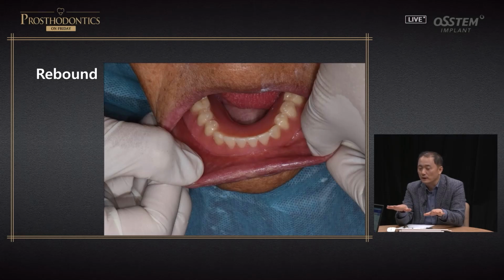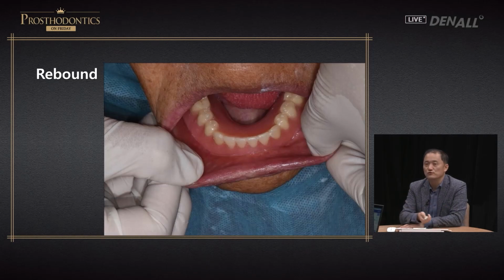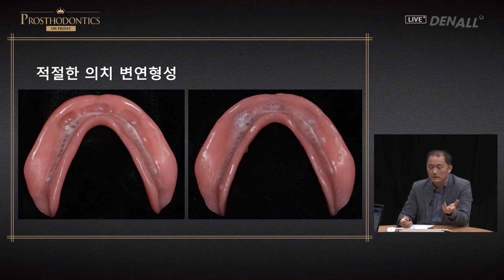In other words, the load that can go in on the side can be eliminated, and you see whether there is a rebound. If the denture goes up, that means on the lingual side there is overextension. If you did this but there's no lift, but if you take your hands out and there's a lift or rebound, then there's a labial side overextension. So with fit checker, rather than that, you check through this approach to see where there's overextension. That is the best way to find the problem area.